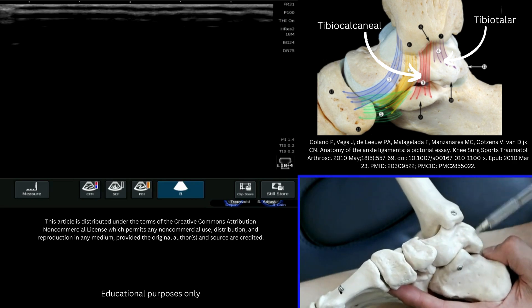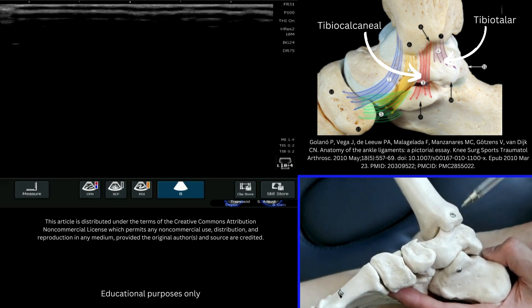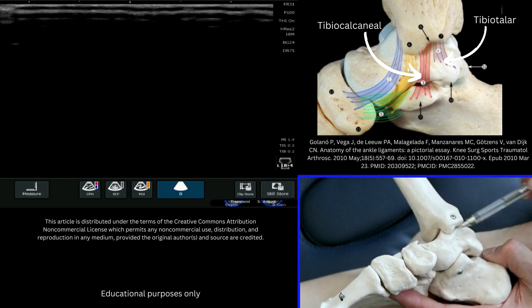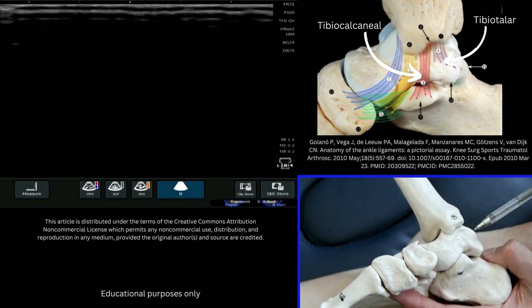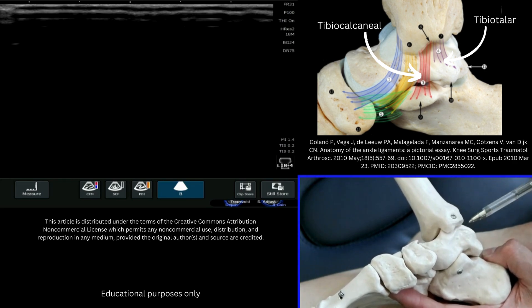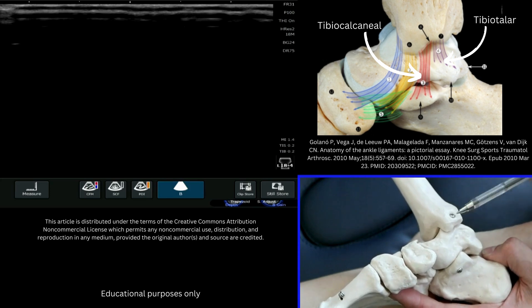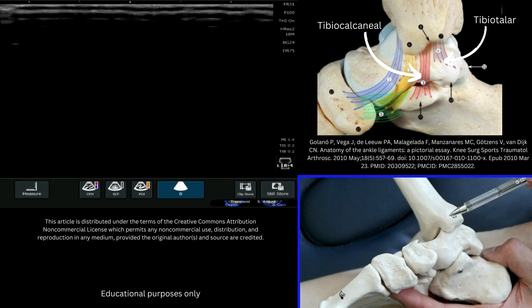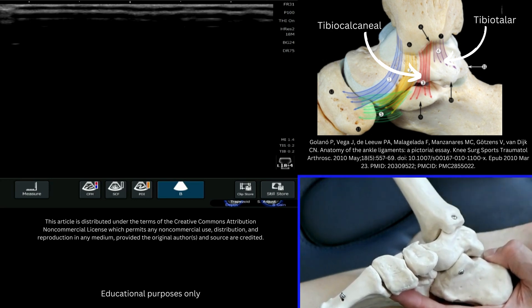We're going to use these bony landmarks to explore first of all the tibiotalar component — this deep, very thick ligament that sits deep in the medial ankle — and then we're going to look for the tibiocalcaneal component which comes from the medial malleolus to the sustentaculum tali.